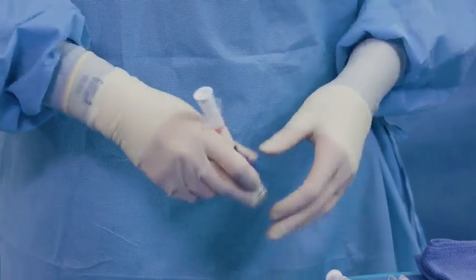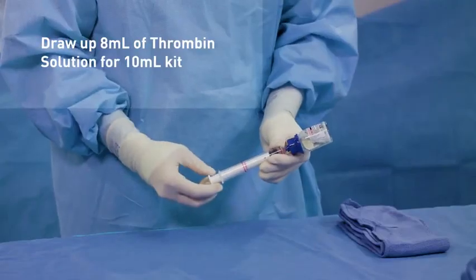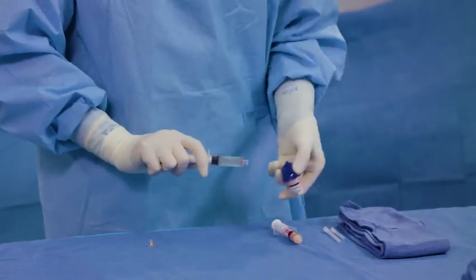Aspirate the thrombin solution to the fill line on the syringe. Draw up to 4 mL of thrombin solution for the FlowSeal Matrix 5 mL kit, or draw up 8 mL for the FlowSeal Matrix 10 mL kit. Remove the syringe from the vial adapter.